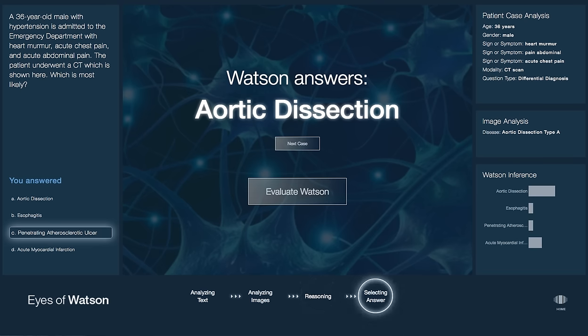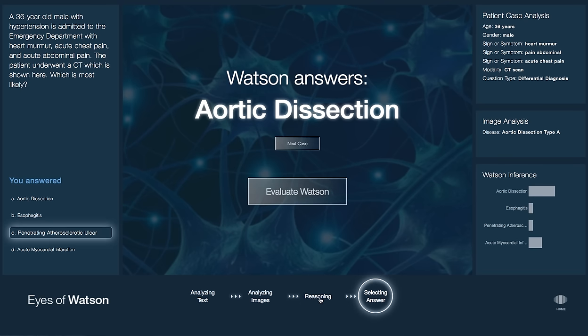If you concur with Watson's inference, you can change your conclusion if you like. You can continue with another case, or take our evaluation survey.